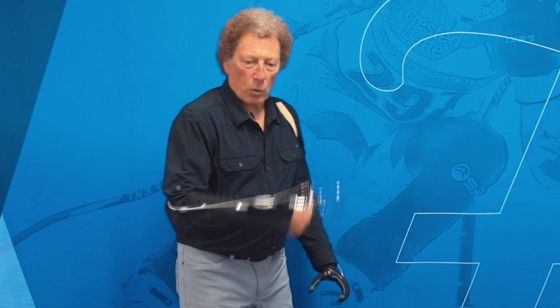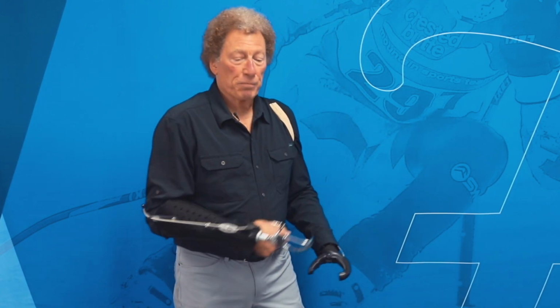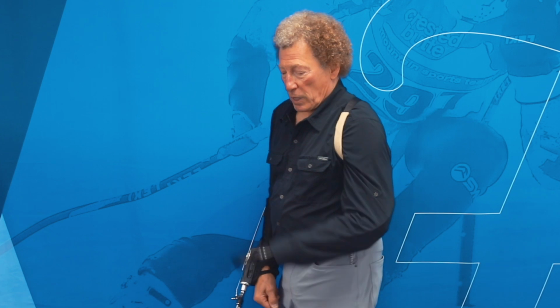Finally, because these are body powered, in my mind it's very important to take advantage of all the various joints that you have available to create energy. So although we can use glenohumeral flexion and scapular abduction, we don't want to ignore elbow flexion. If the device is properly cabled with a good crossbar strap that allows you to capture energy at the elbow, then with a voluntary closing device, just with elbow flexion or forearm flexion or abduction, adduction of the humerus, I can open and close this hook. And the same with a prehensor, even more efficiently, with just elbow flexion or adduction at the humerus.